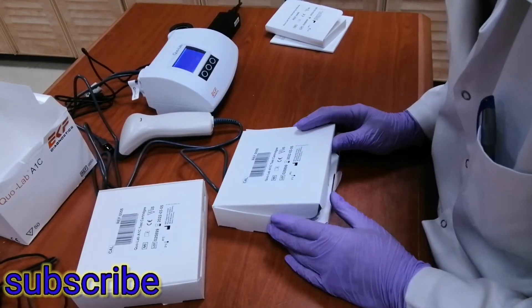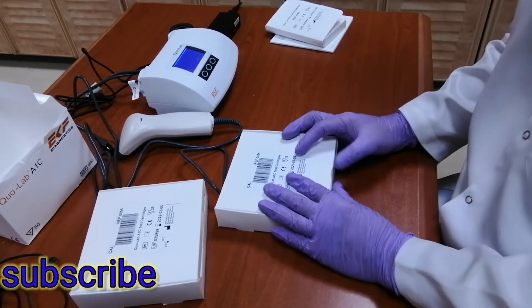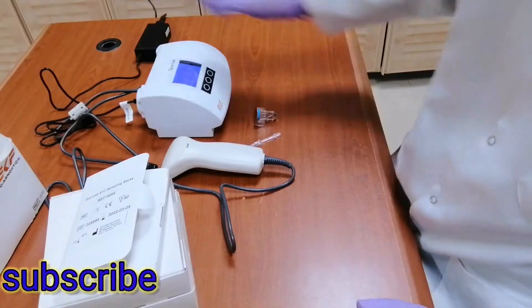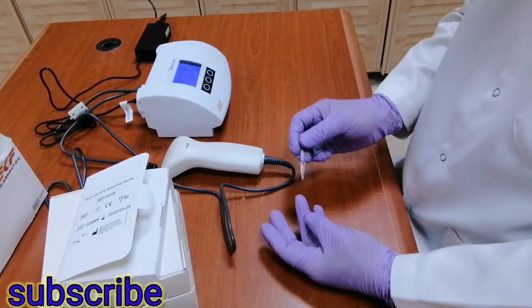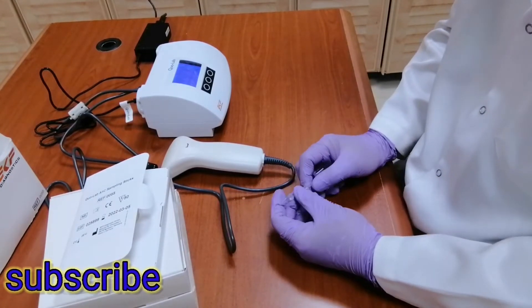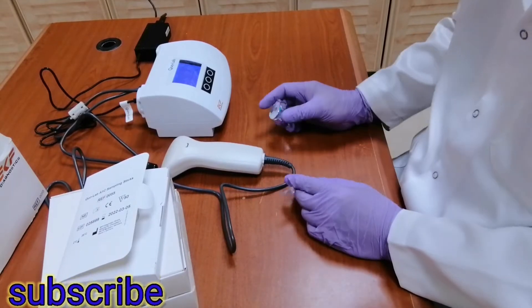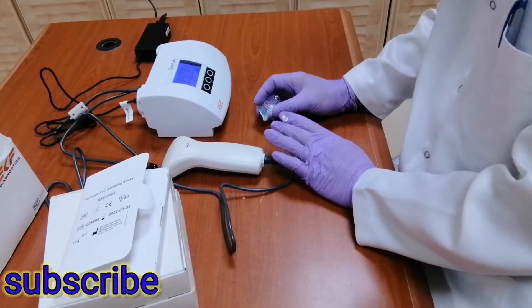So we will try to run one patient — rather, I will get blood from myself to run one sample in this machine. By the way, you can use samples by pricking or by venous blood collected in EDTA. What I will do is use venous blood — I don't like any prick because pricking is very painful, so venous blood is better.